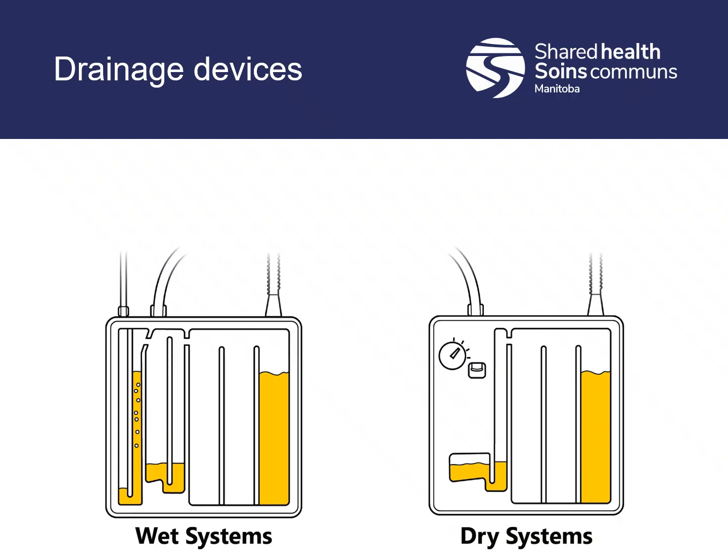In the wet suction system, the water level controls the negative pressure. As water evaporates, though, the negative pressure can change, so it's important to check the water level frequently. That's why we need to talk with the sending facility, because if that's something we have to keep an eye on while we're transporting, that's really important to know. If we have to keep checking water levels, what do we do if the water levels drop? That's a discussion to have before you take your patient.